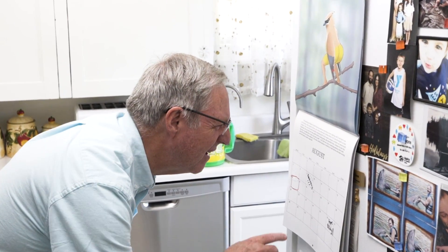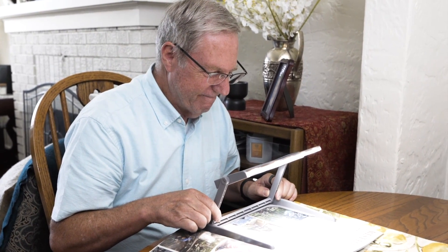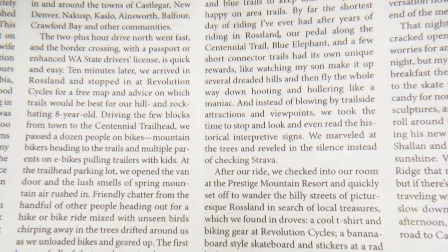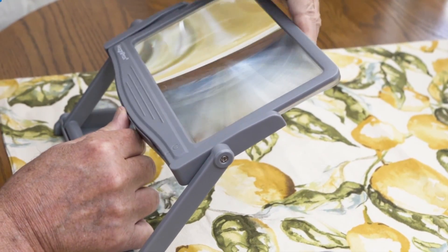Having a hard time seeing small text? Or is your glasses not doing the trick for you? Do you wish you had a solution to your vision problem? Introducing the 5X LED Rechargeable Page Magnifier with Stand. With this magnifier, you will never have to struggle seeing small text or see the smallest of details of your project.